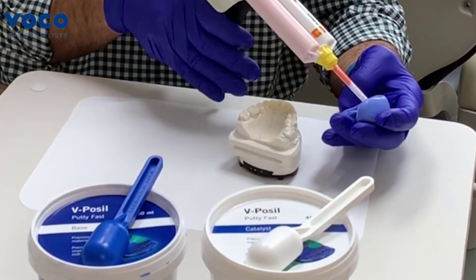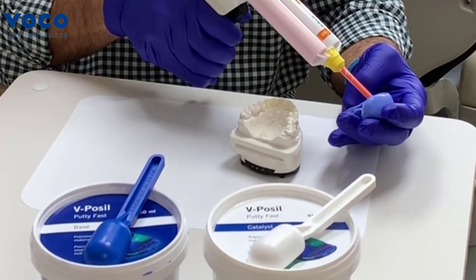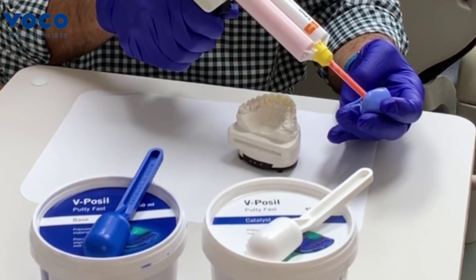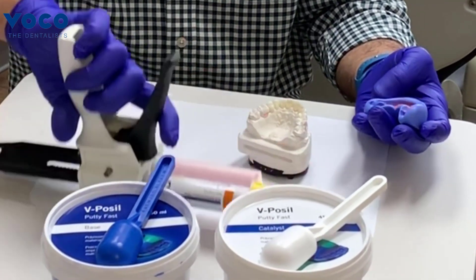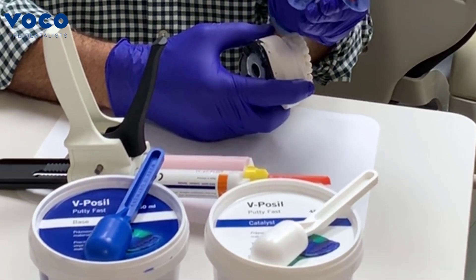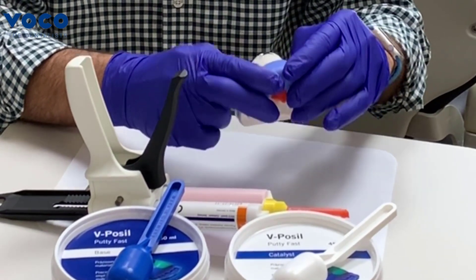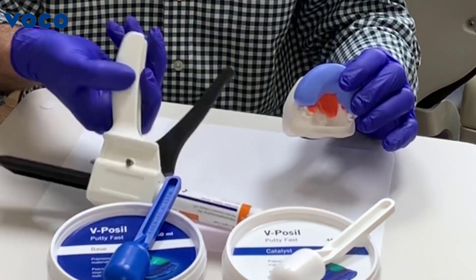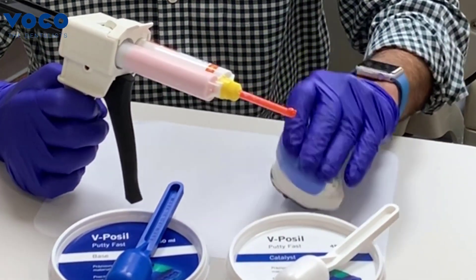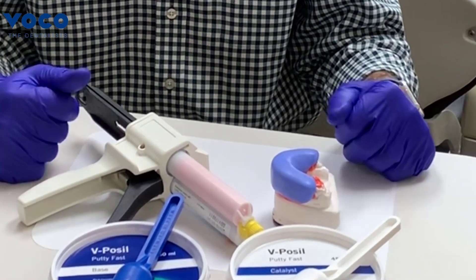At this point we'll go ahead and fill from teeth 5 through 12. One thing I failed to mention about the matrix is you want to make sure you always get at least one tooth beyond the area you're going to be working on. We've gone ahead and filled our putty matrix with the light body impression material and we're just going to reseat that matrix. This impression material also takes about four minutes to set, so we'll let it set and then we'll come back and talk about trimming the putty matrix.